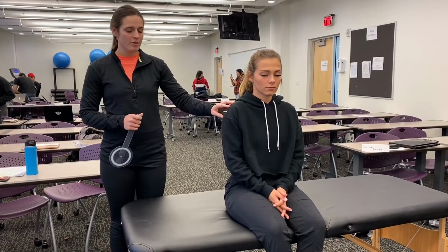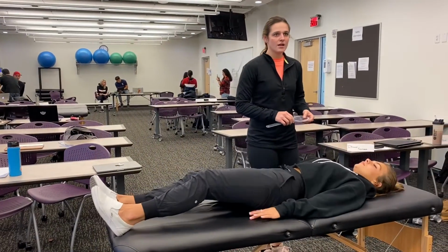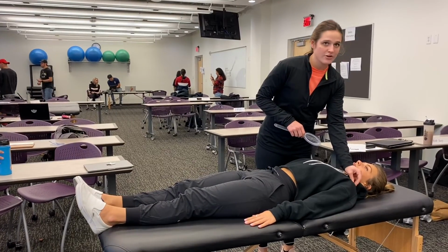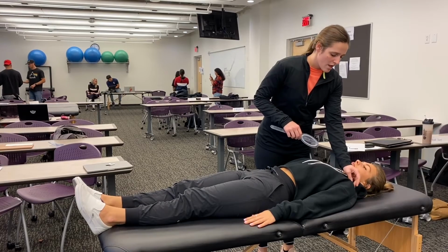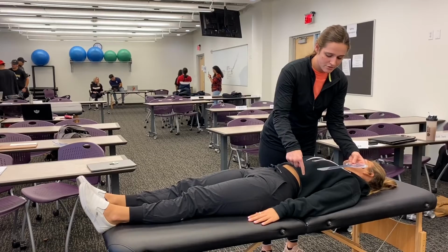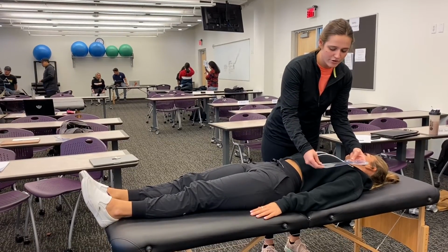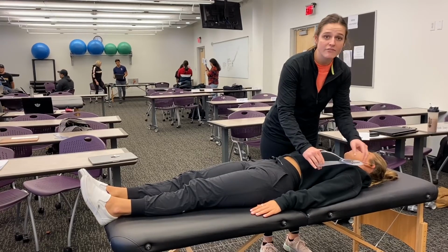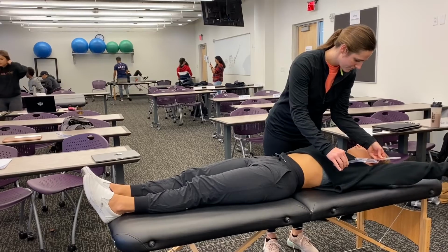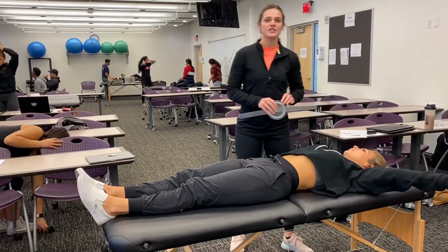I'm going to instruct my partner to lie down on the mat table. The axis of rotation is the anterior aspect of her acromion. And then the stationary arm is going to be parallel to her thorax, and the mobile arm is going to be in the midline of her humerus. And when she's ready, I'm going to have her abduct her arm. Go ahead. Great job. That's 170 degrees.